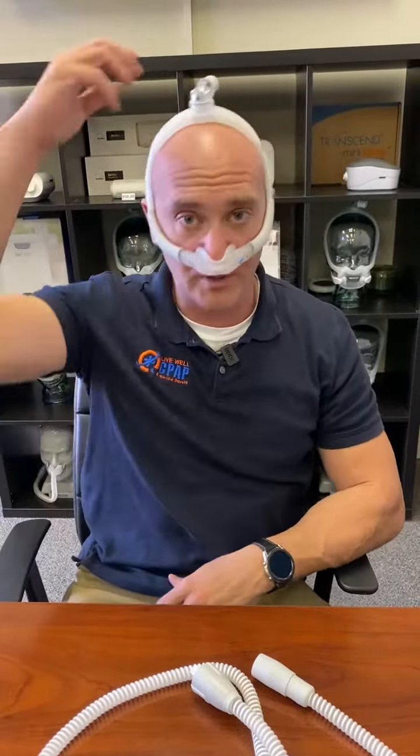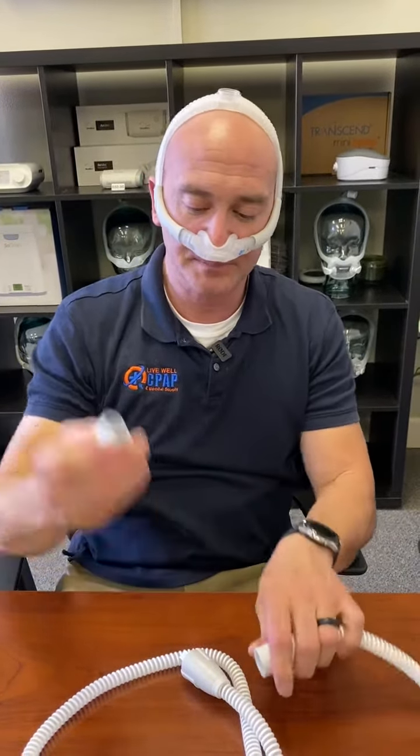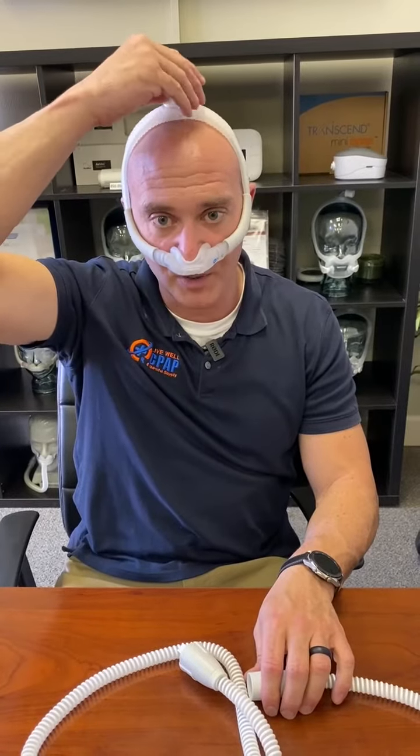With this particular mask, it's a very simple mask. You've got two adjustments on the side, but what I tell people — it sounds terrible — it's like a horse harness. Put it under your nose, pull it up and over, and down and around. Make sure your nose is right in the middle, and then adjust the velcro on the sides.